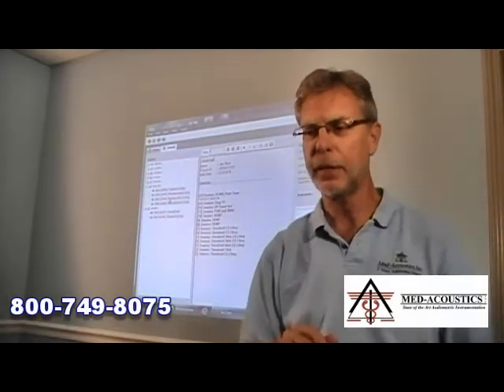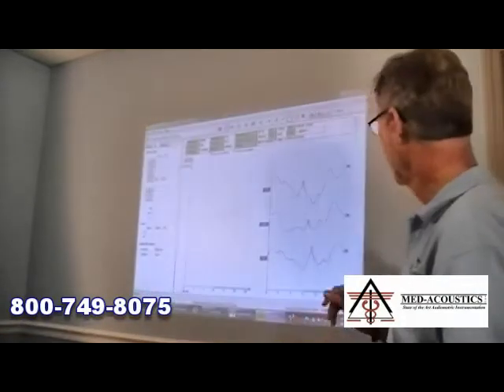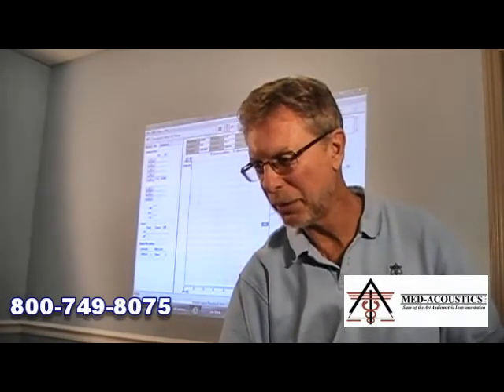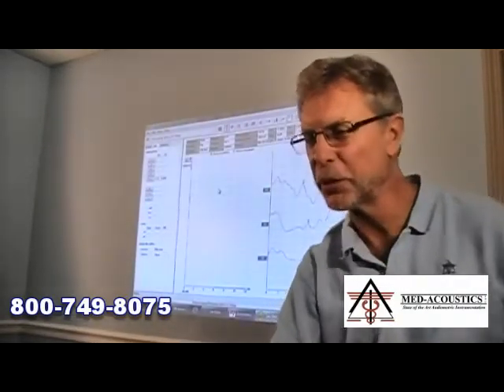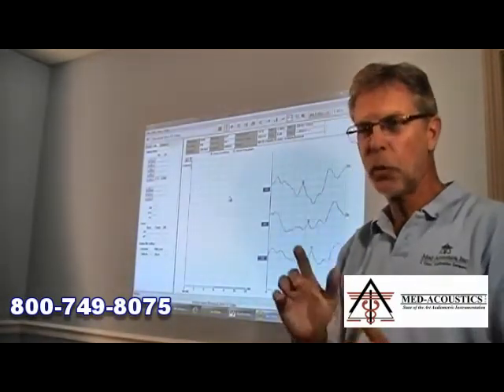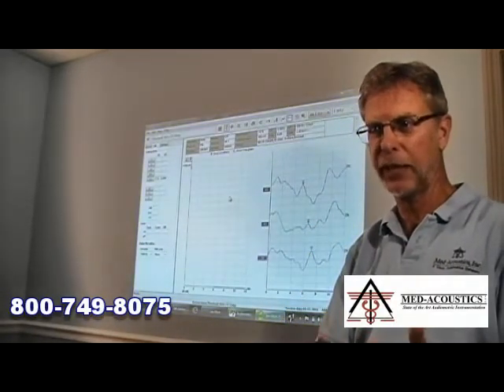Okay, here's a 2,000 hertz chirp. Let's see if we like that better than a 2,000 hertz tone burst. Well, pretty good. Does it replicate? Well, let's go down to the threshold that we found and go to our AB. Pretty good, huh? Not running a replication run, but right down the threshold, pretty solid there. Okay. My producer is telling me to move over. Okay. Anyway, so we've looked at the VEMP application as well as the ABR application.